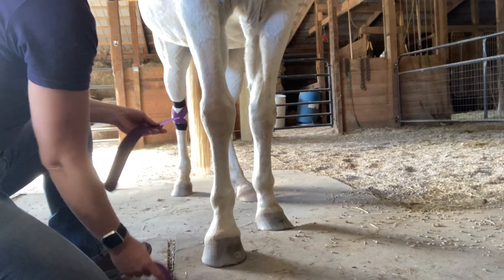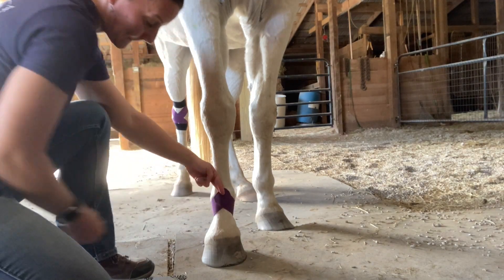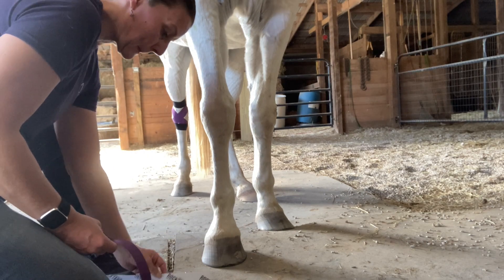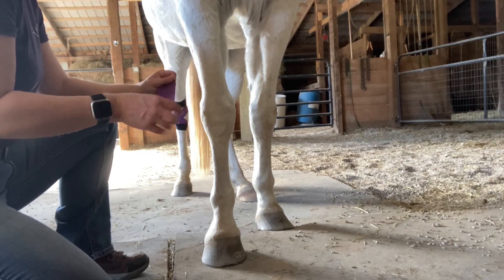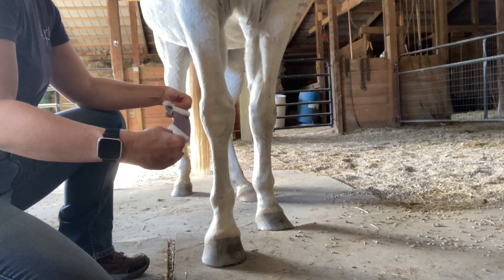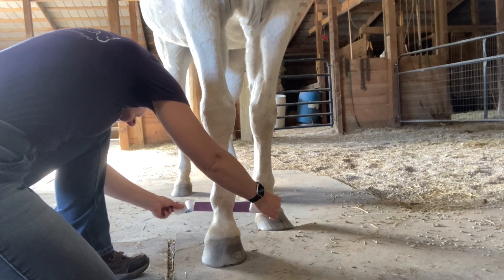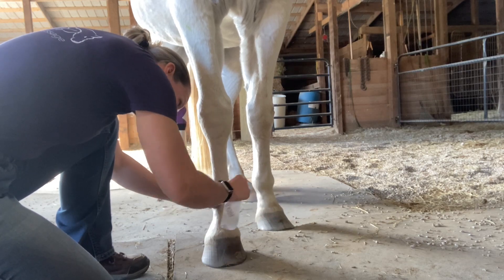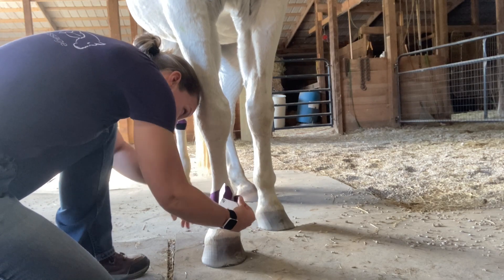For this fetlock support taping, you're going to cut three identical eye tapes that somewhat sling around the backside of the fetlock and cross over the front. Starting with the first tape, you're going to make a middle break. Pull your backing to your ends. Apply this right at the middle of the back of the fetlock with a mild stretch, no stretch on the ends in the front, and you're going to overlap those ends, cross one over the other.